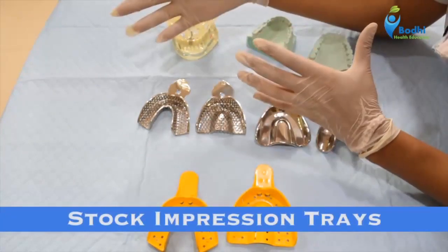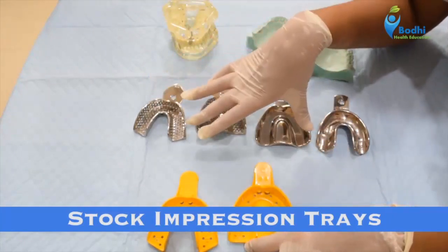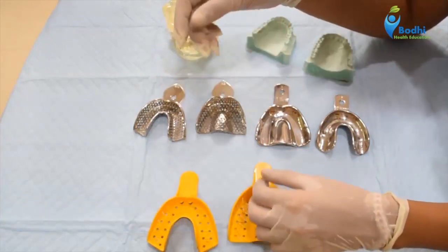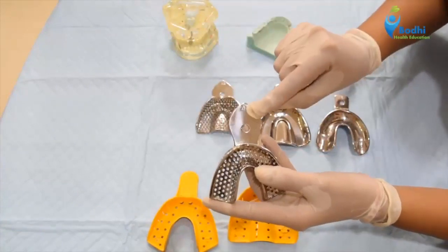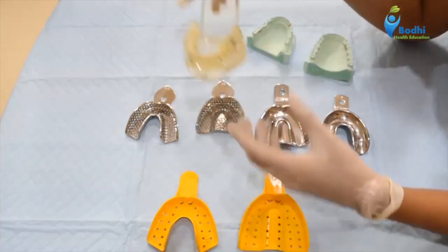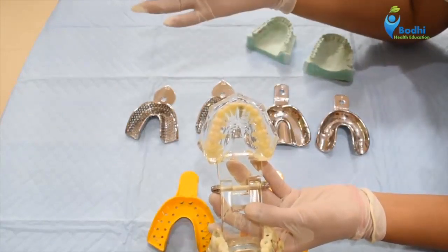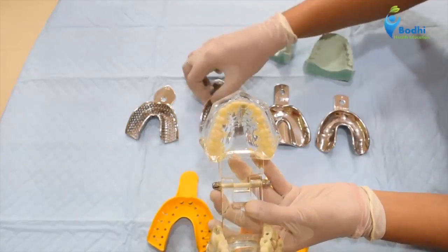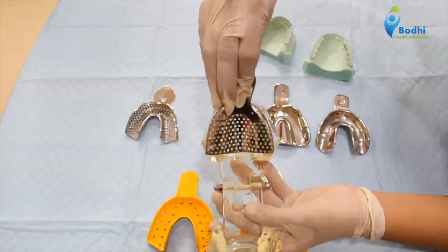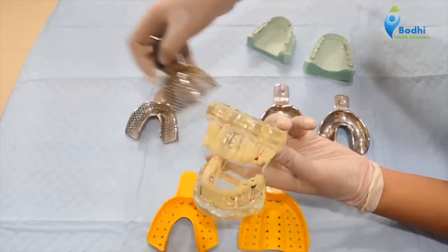So the impression trays can also be classified as the stock impression trays. These are all stock impression trays. They are prefabricated. They come in various sizes, from extra small to large sized impression trays. Depending upon the jaw size of the patient, the impression tray can be chosen for the accurate size. So for the maxillary impression tray selection, the size can be checked by keeping it in the patient's mouth like this. We can check for the clearance and the size of the tray.